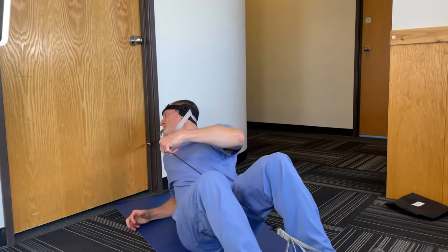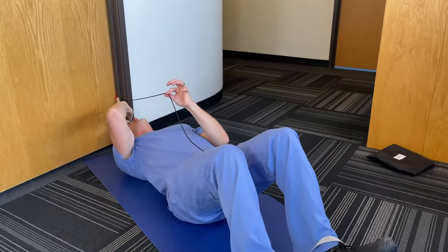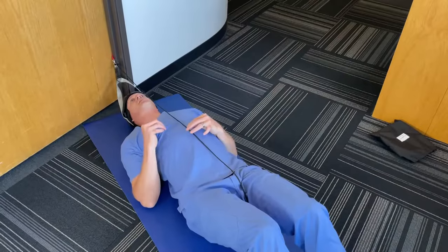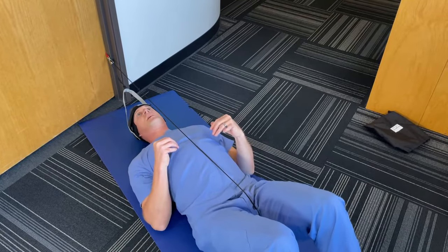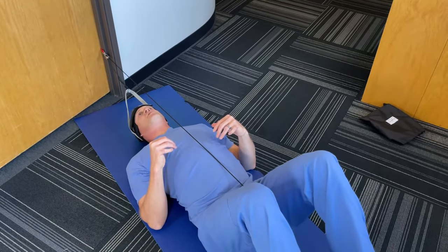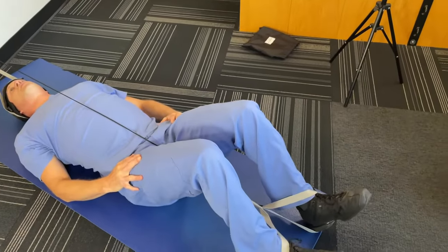Lay down and get yourself positioned so the tensioning cable is in line above your nose. Then position yourself down and slide down, but make sure you have about a 30 to 40 degree bend in your knees when you get into position.